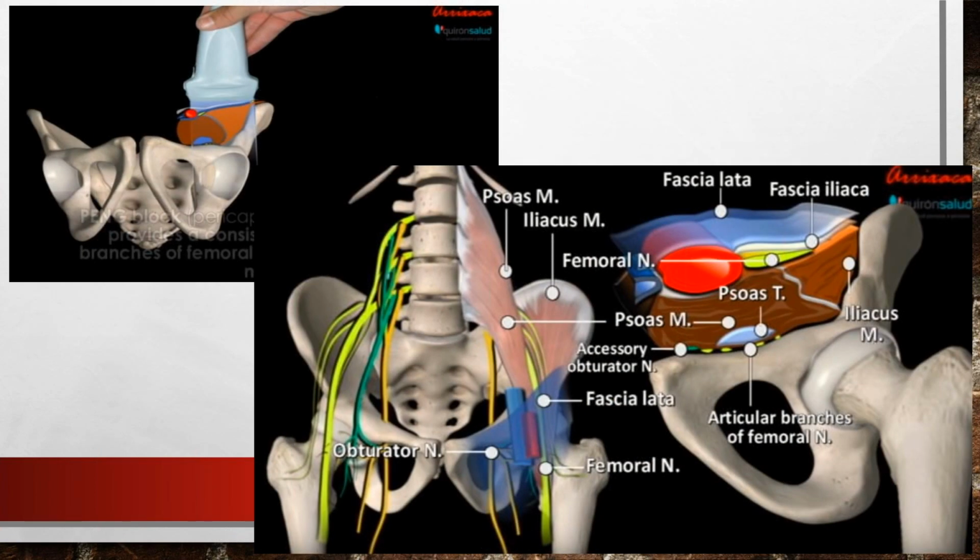This is a very crucial, very important structure when we perform the fascia iliaca and PENG block. When we position our probe beside the axis of the femoral inguinal ligament, we can view structures from superficial to deep. After the soft tissue, we reach the fascia lata.